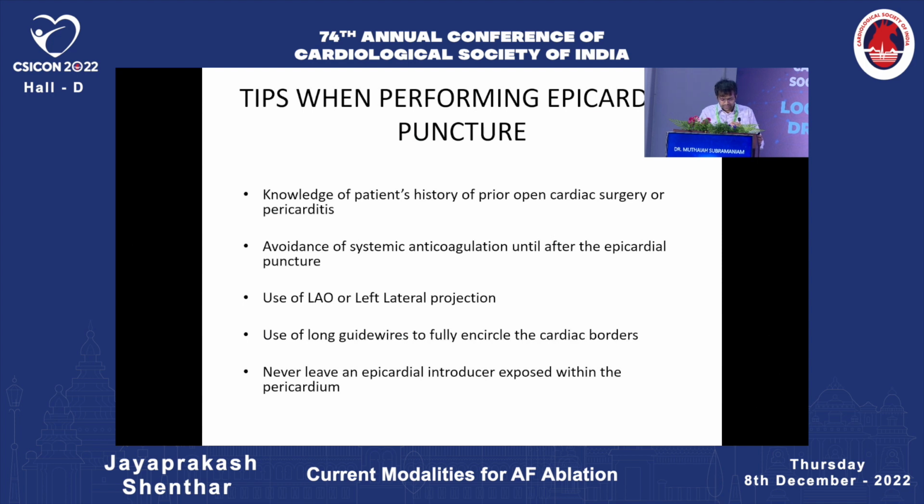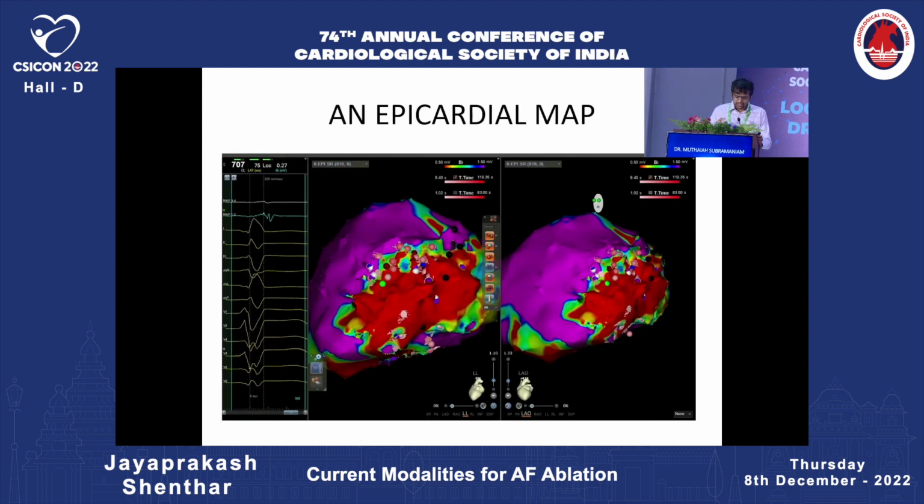Using LAO or left lateral is up to the operator, and never leave your epicardial introducer exposed. Always keep at least a dummy catheter inside. Sometimes you can map the epicardium, and I'm not going to go fully into the mapping techniques, but one slightly different thing in the epicardium compared to the endocardium is that it is slightly easier to move around the epicardium because it is a freer space.